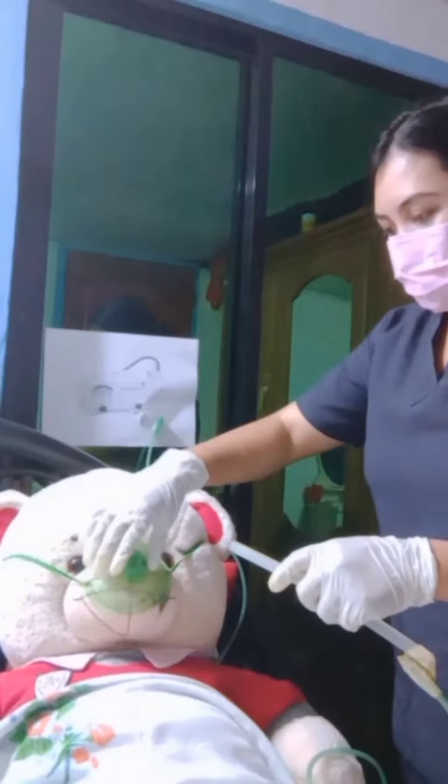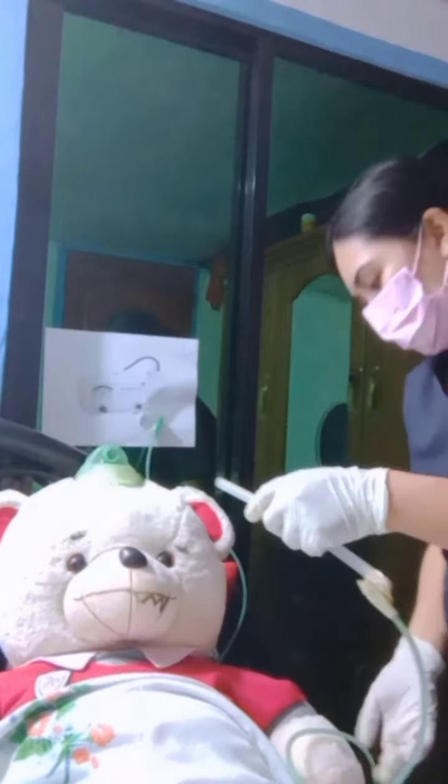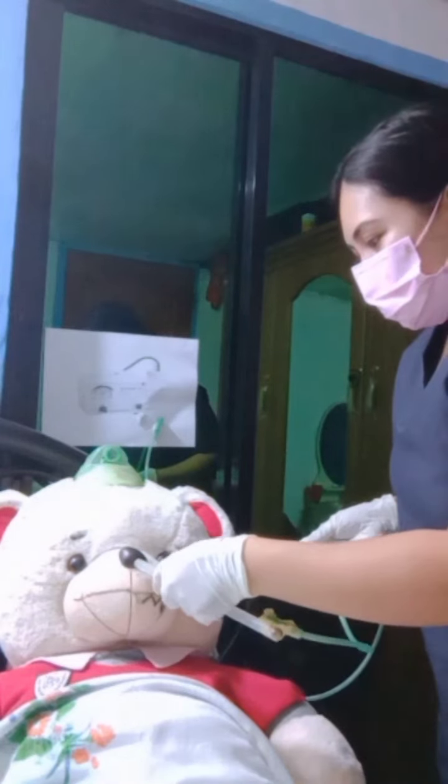Use your dominant thumb and forefinger to insert the catheter gently but quickly into one of her nares as she inhales. As you insert the catheter, do not cover the catheter vent. Follow the natural course of the nares. Orient the catheter downward slightly. Don't force it. Inhale deeply.